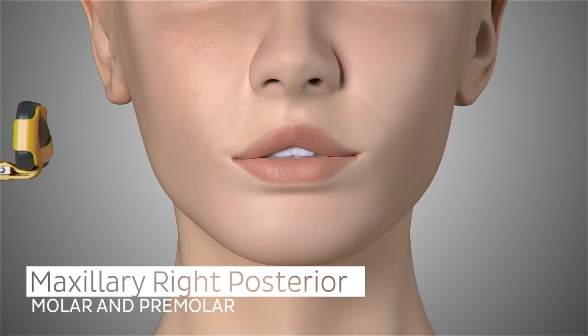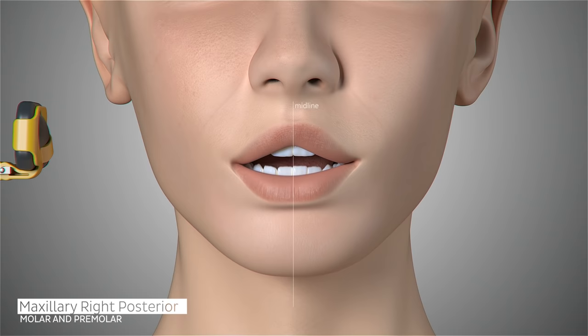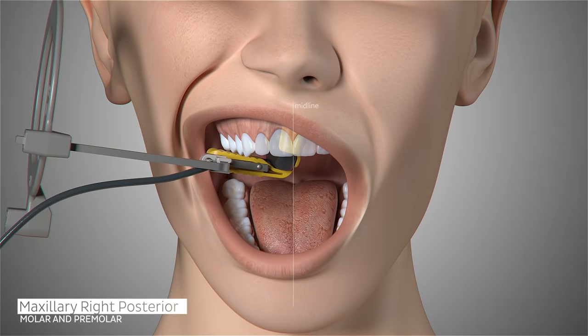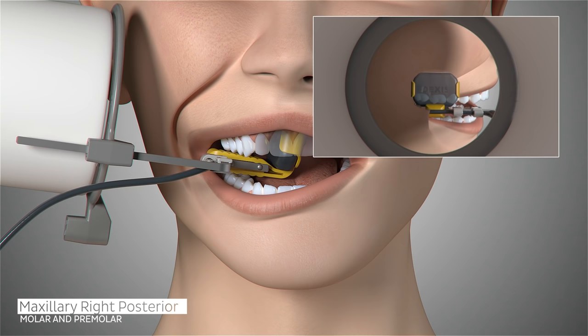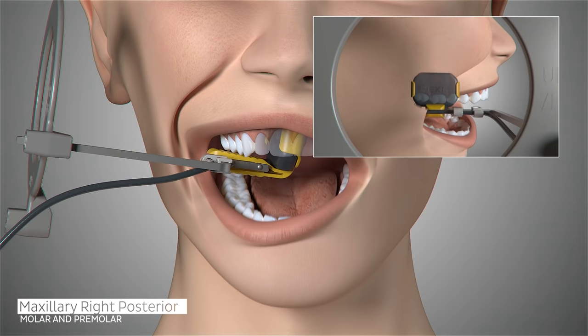The first image in our full series will be the patient's maxillary right molar. Position the sensor in the patient's mouth toward the midline of the palate, parallel to the roots of the molar and centered on the first molar. Ask the patient to close and slide the aiming ring as close to the patient's cheek as possible. The cone of the x-ray emitter must be placed flush with the aiming ring and then trigger your exposure.